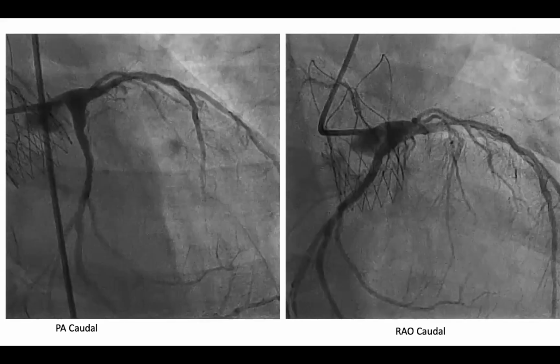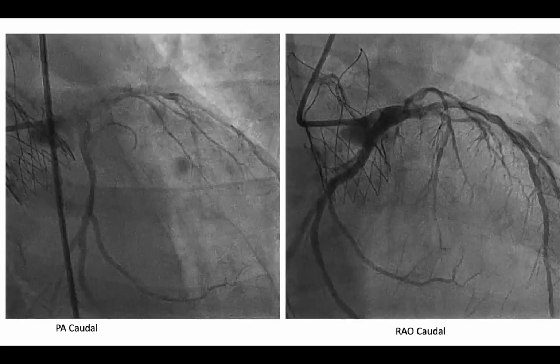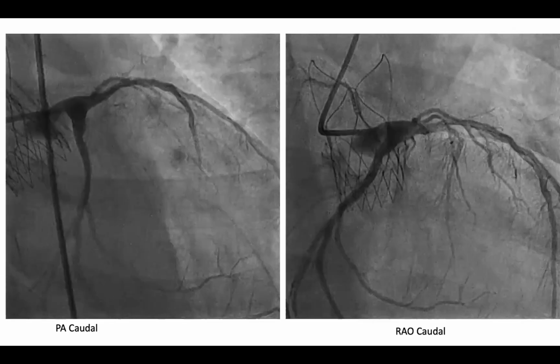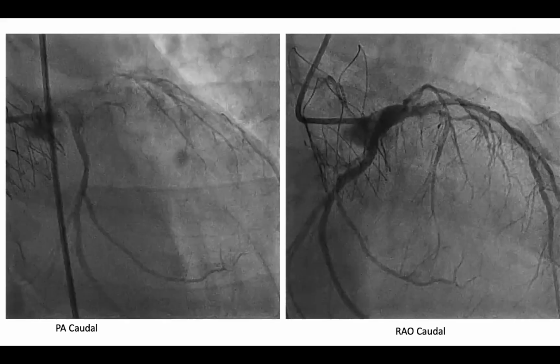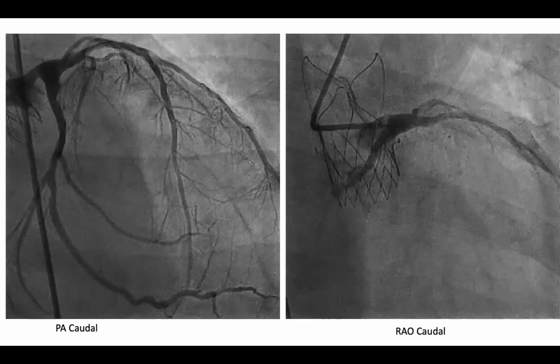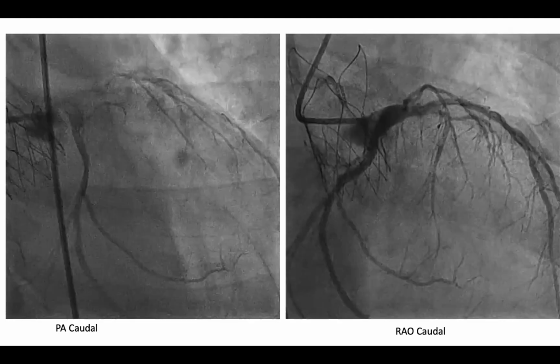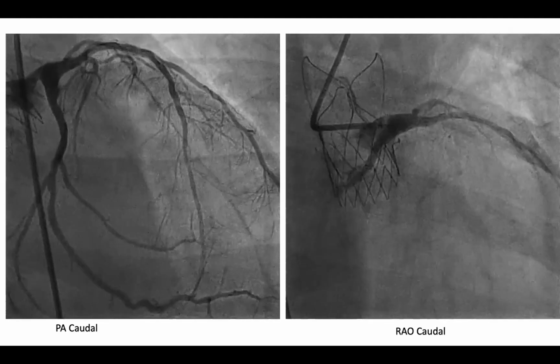Considering that she had low blood pressure and we felt that she may have cardiogenic shock, in order to preempt any insertion of an intra-aortic balloon pump later on, we felt that it would be easier and safer if we go for the femoral approach. Yeah, I think it's interesting.